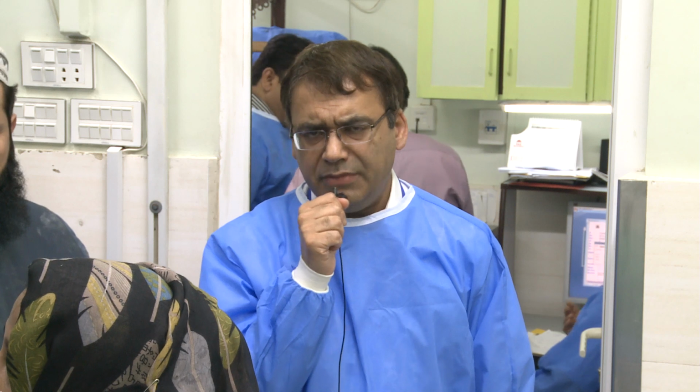So type 1, the treatment is really a sphincterotomy. You don't need to do any manometry. With type 2, I don't know what Mustafa's opinion is, but some people still do a manometry, others don't, and these patients also require a sphincterotomy. The only thing doing a manometry and checking the pressures would do is give you a diagnosis. But keep in mind, with sphincter of Oddi manometry, even if the patient has the sphincter problem, 25% of the time they may have normal pressures when you check with manometry. So I'm going to come over there if there are any questions about that. Happy to answer that.